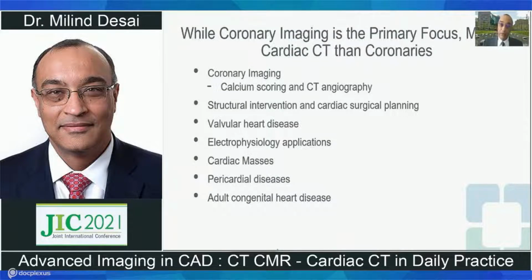The other focus of cardiac CT in clinical practice, which is a huge focus nowadays, is planning of a structural intervention like transcatheter aortic valve replacement, mitral valve replacement, tricuspid valve, as well as preoperative planning prior to cardiac surgery. Additionally, there's a role in other aspects of valvular disease.